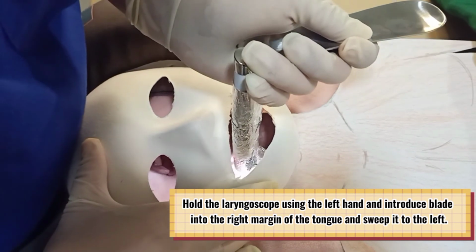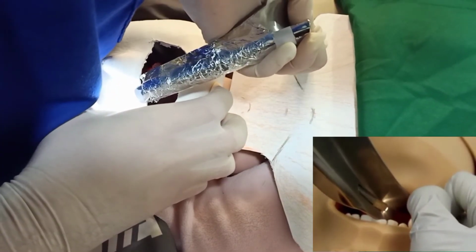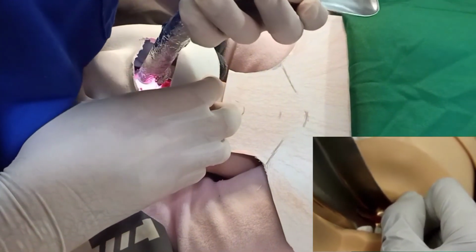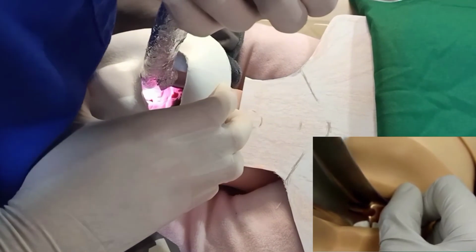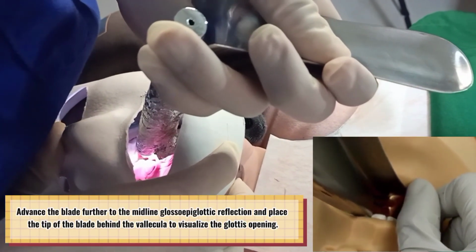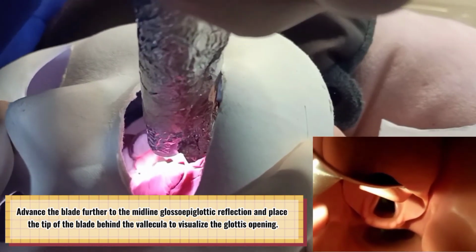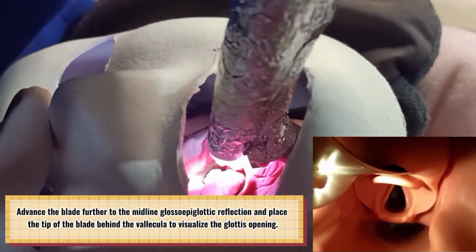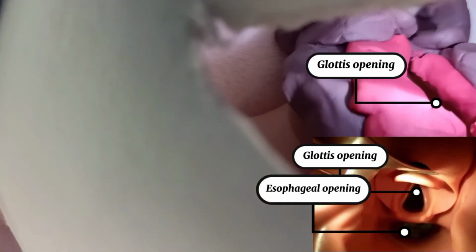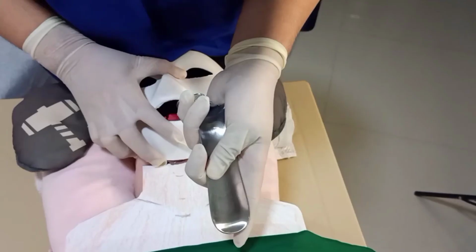Introduce the blade at the right corner of the mouth and sweep the tongue to the left. Now advance the blade until the right tonsillar fossa is identified. Locate the epiglottis medial to the tonsillar fossa and advance the blade further to the midline glossoepiglottic reflection, placing the tip of the blade behind the vallecula to visualize the glottis opening. This will also allow you to distinguish the glottis opening from the esophagus to avoid esophageal intubation.